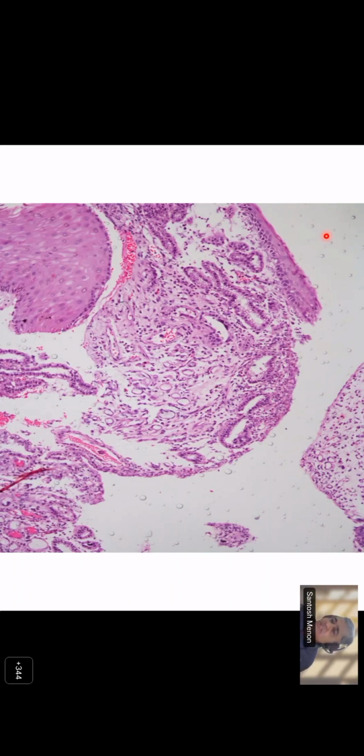Okay. So it's a urethra, and this works very well with the urethra. Urethra can show some squamous change. That's what it is. And anything else, you want to say? You agree with what Parul said, that there are capillaries and fibrovascular tissue? Congested capillaries and some edema can be seen, sir. Okay, and you want me to go to the next slide?